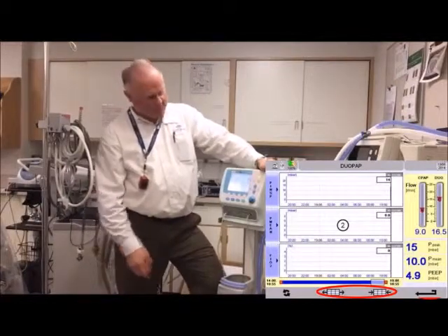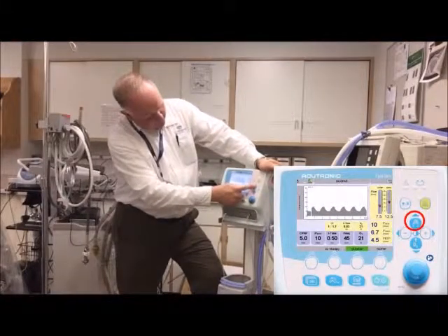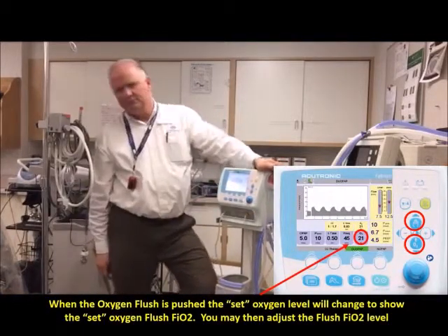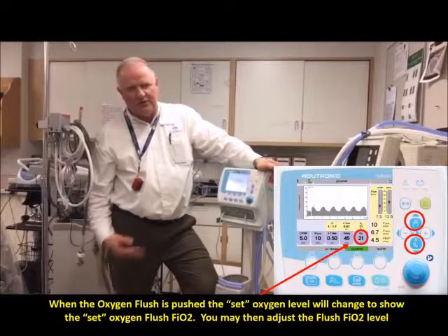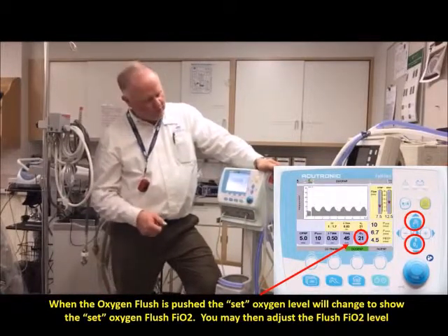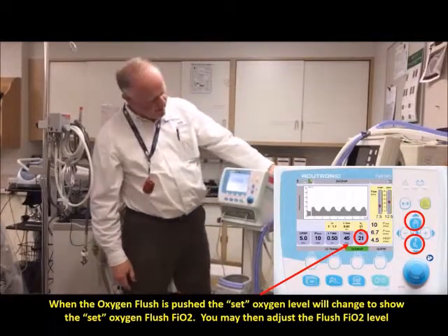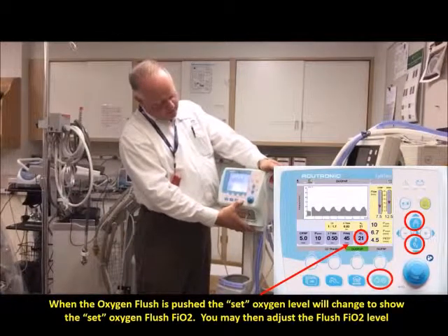You can give a manual breath using that button. To change the oxygen flush, push the flush button to turn it on and then you can adjust it down. Any questions? It's all relatively simple — a lot of different little functions but none of them are really hard; it's pretty intuitive. I've left the manual for you — it's a better source than I am, even though I know everyone loves reading manuals.